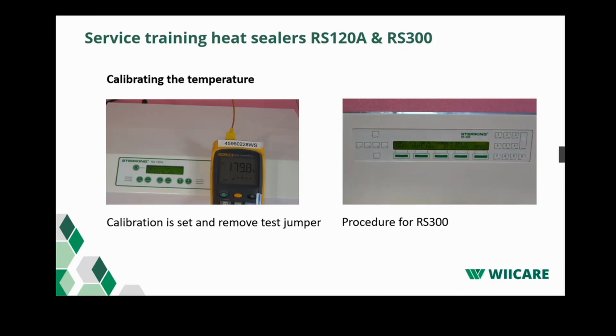To adjust the print temperature, use push buttons left arrow and right arrow. With left arrow you decrease the value, and with right arrow you increase the value.